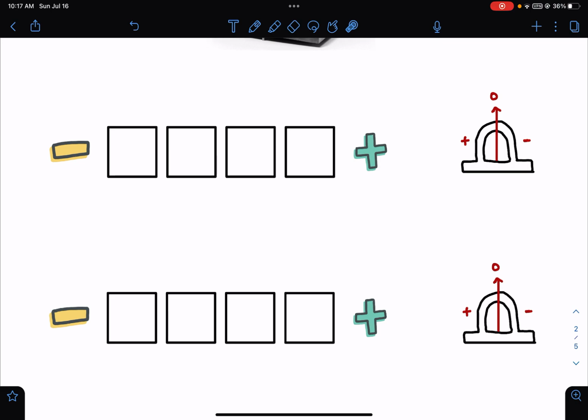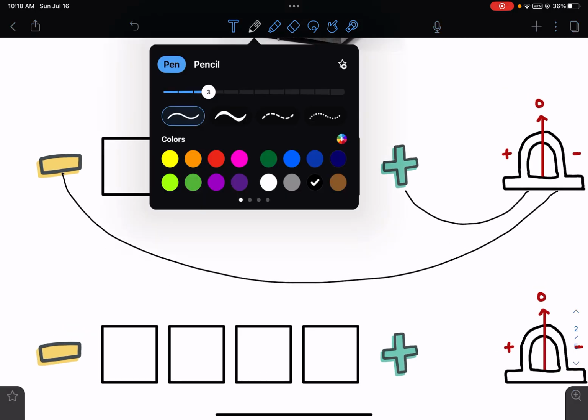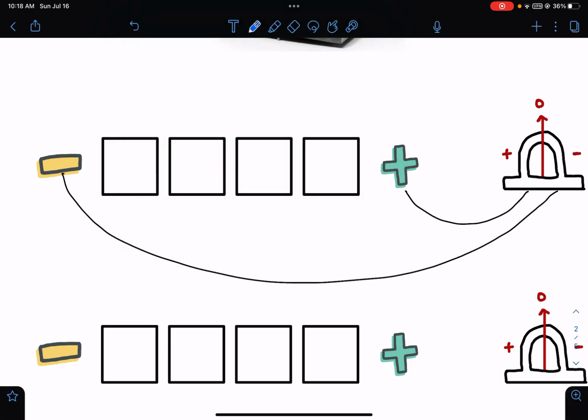If we section the cardiac muscle like that, here is your negative pole, here is your positive pole. So to detect the electrical activities in the cardiac muscle, we will connect it to our galvanometer, right? One for the negative pole, one for the positive pole. Okay, so here it will stimulate our cardiac muscle contraction from that point, right? From that point, there will be action potential in this source.